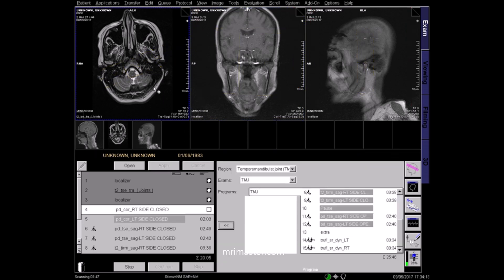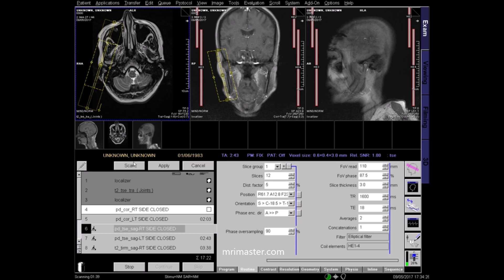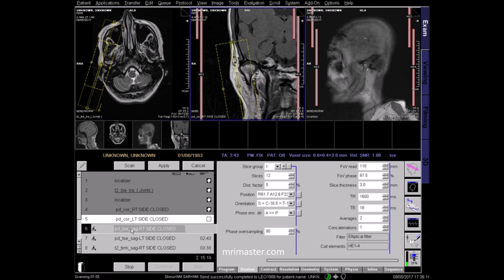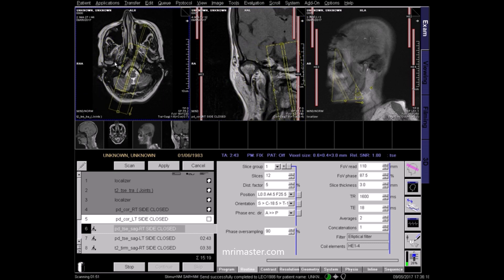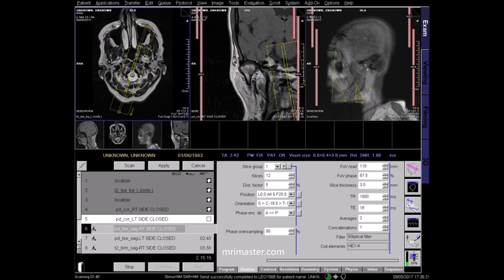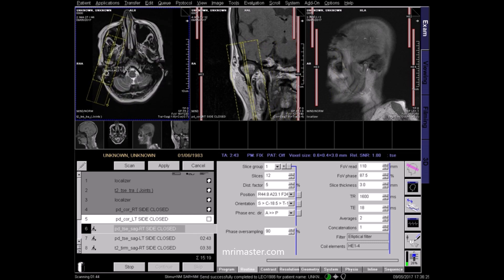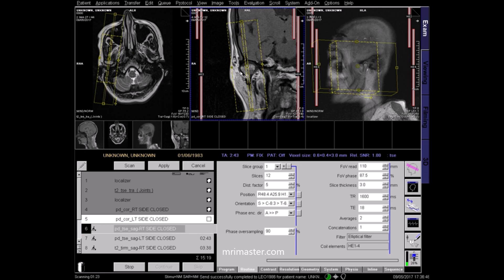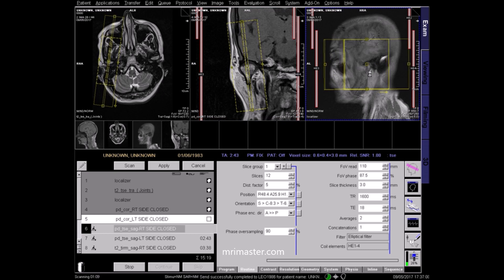Next, plan the sagittal PD and T2 STIR sequences of the right and left TMJs. Bring up the acquired right coronal PD images. On the axial image, plan the right PD sagittal sequence perpendicular to the long axis of the mandibular condyle. On the coronal plane, centre to the joint and angle along the right ramus of the mandible. Adjust the centring in the sagittal plane and apply.